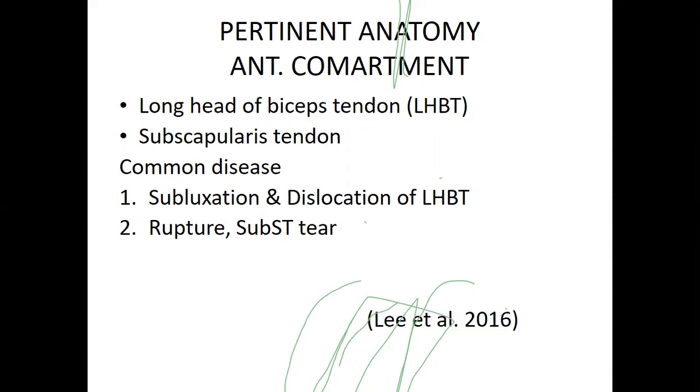The rupture of the subscapularis and its involvement in the tears. Like I mentioned, the subscapularis tendon, you also appreciate its insertion, and you are going to appreciate where it's inserting. So all those ruptures and involvement we are going to see.